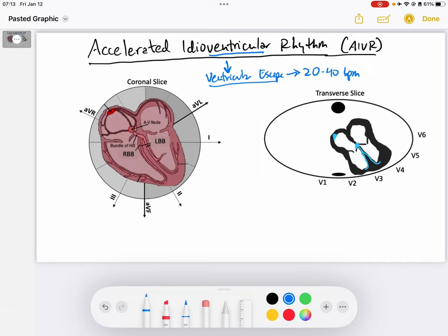But in this case, as its name also implies, this is an accelerated rhythm. So this is essentially going to be a ventricular escape rhythm, but instead of being 20 to 40 beats per minute, it's going to be maybe 40 to 100 beats per minute.